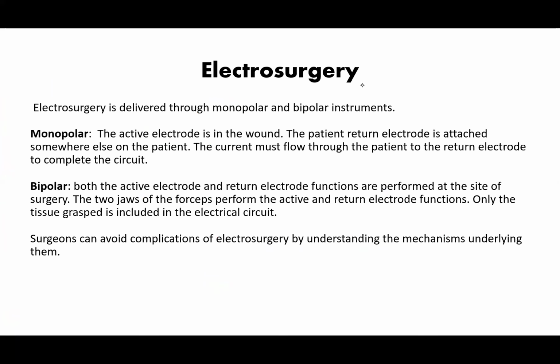Now electrosurgery, as we said, is derived through either monopolar or bipolar instruments. Now, in the monopolar instrument, the active electrode is in the wound.